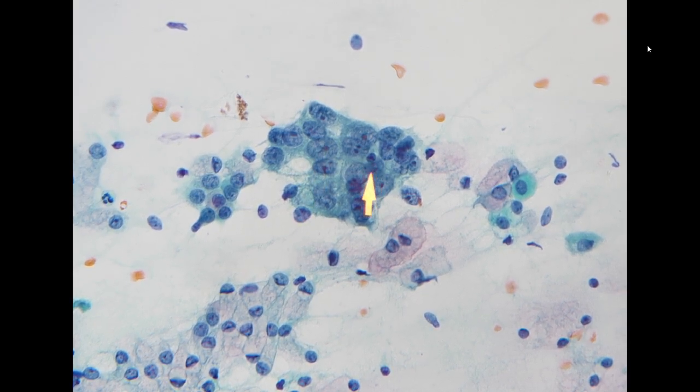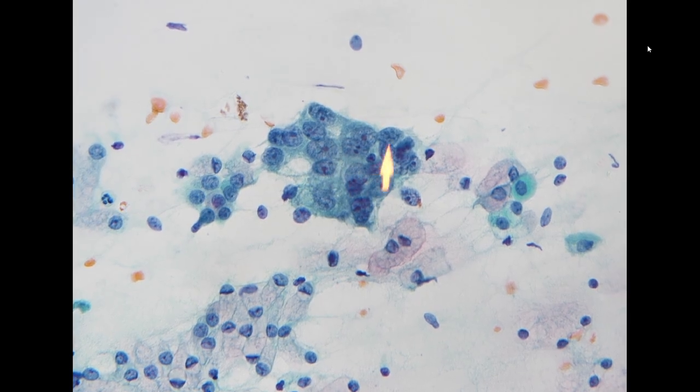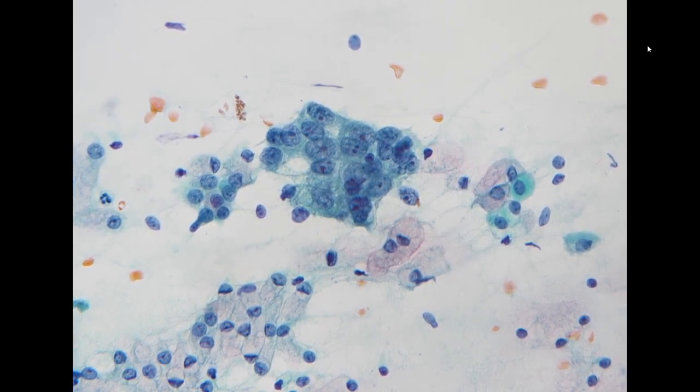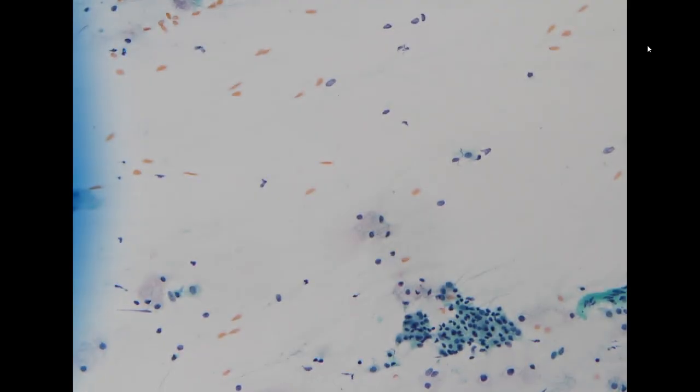However, I would argue that it doesn't look much like repair because the cytoplasm is too fluffy. It's not very dense. It looks like glandular cells with high-grade atypia. So this pattern is unusual, right? Because in the background we do not see anything. In the adjacent endocervical cells, we do not see any reactive type of change.